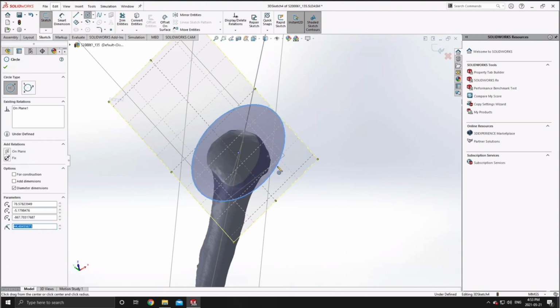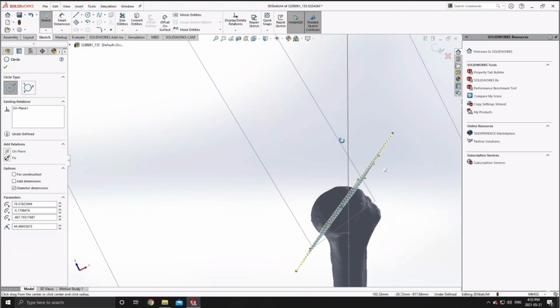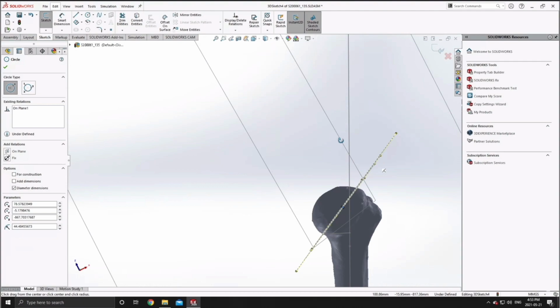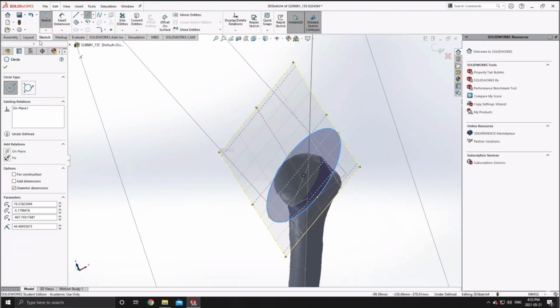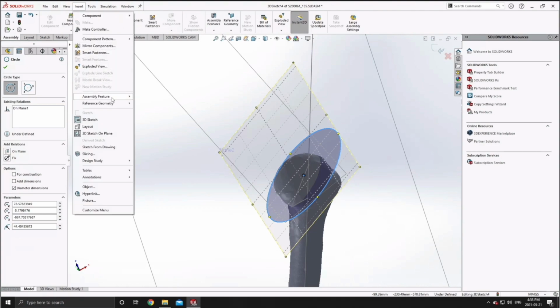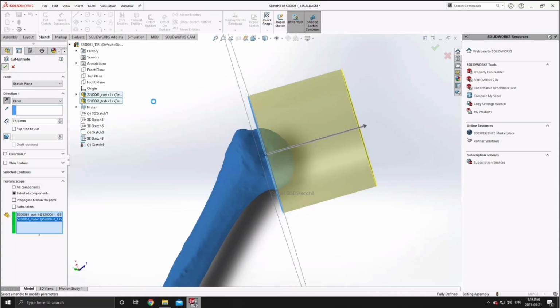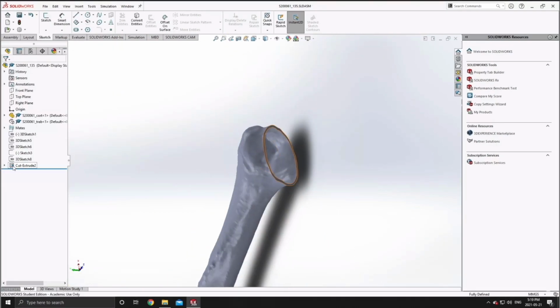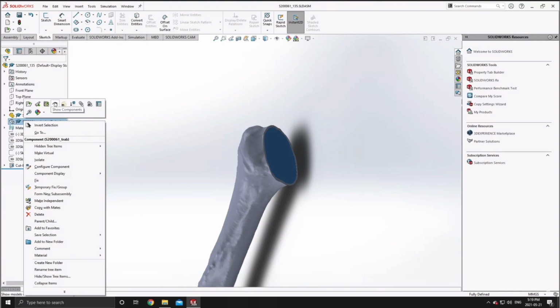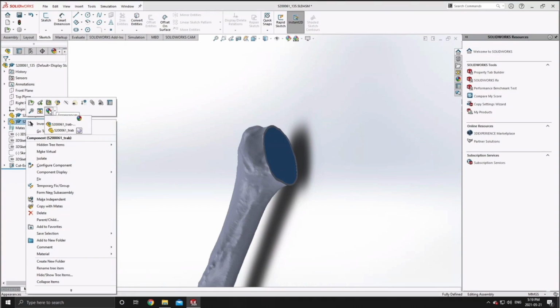As you can see here, after indicating which plane I want to make my cut on, I'm just choosing an arbitrary point and making an oversized circle sketch in order to make that resection cut that one would ordinarily perform in a surgical suite using an oscillating saw. Okay, so now that we've isolated the cut, I'm actually just going to make my trabecular bone model visible, and I'm going to change the color, as moving forward, it'll just make our lives a little bit easier.